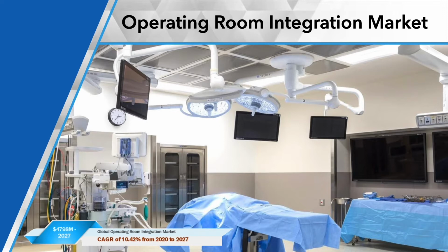It's an integrated operating room, so there's very little cable on the floor. Everything is managed either through the booms or through the walls. So the large displays are primarily used for multiple images, like multi-view options, where you can show a patient life monitoring system. You could have PACS images being pulled up. So they're all medical grade displays, not the usual AV displays. That's one of the differences between ORI and a professional pro AV application.